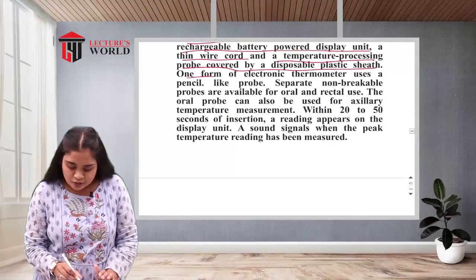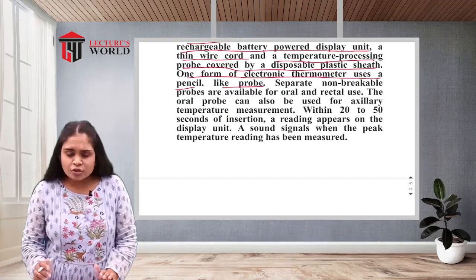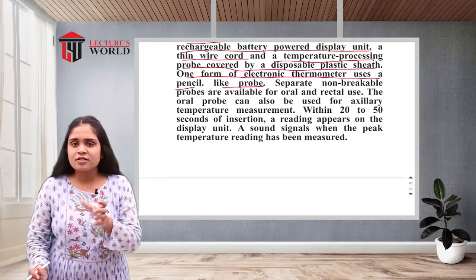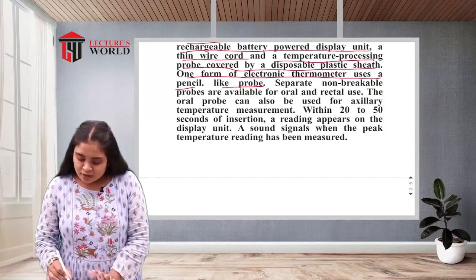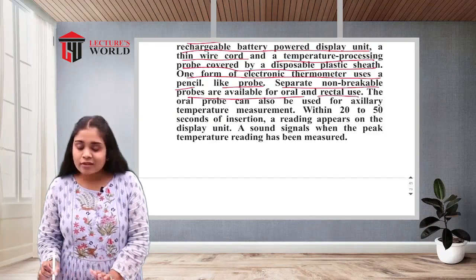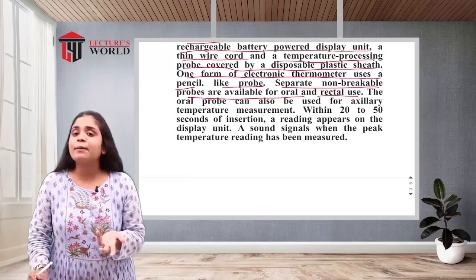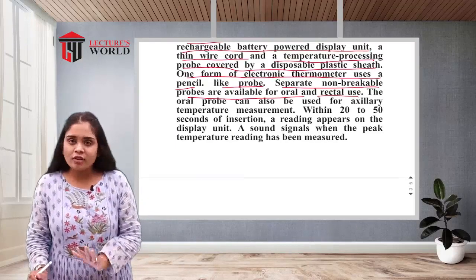One form of electronic thermometer uses a pencil-like probe. You can say this looks like a pencil only. Separate non-breakable probes are available for oral and rectal use. Separate non-breakable probes are available for oral and also for rectal use.